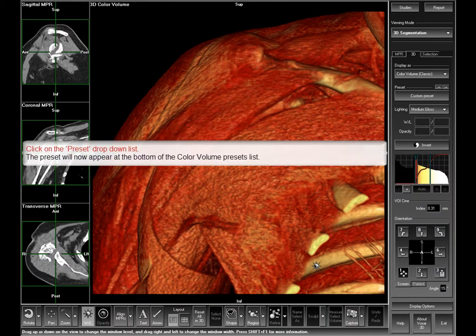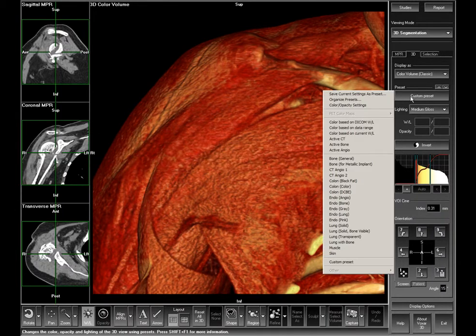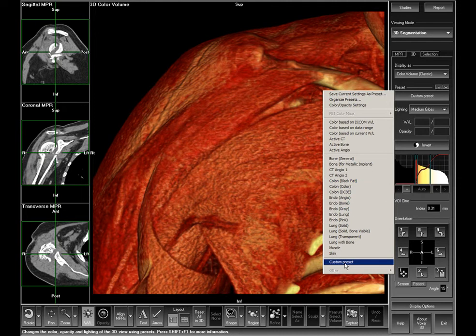To view the newly created preset, click on the preset drop-down tab. Your custom preset is now located at the bottom of the color volume preset list.